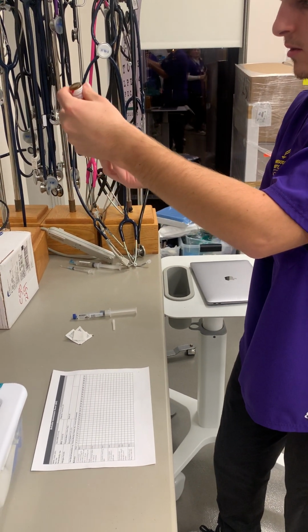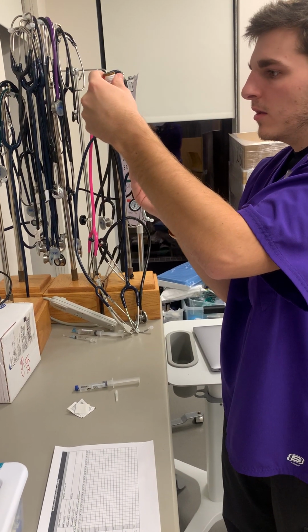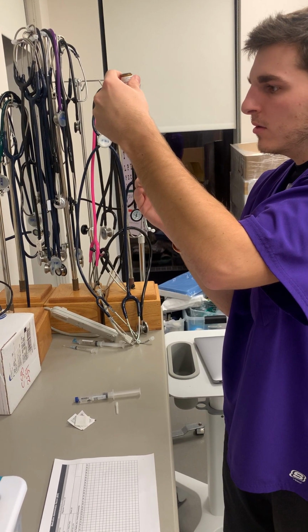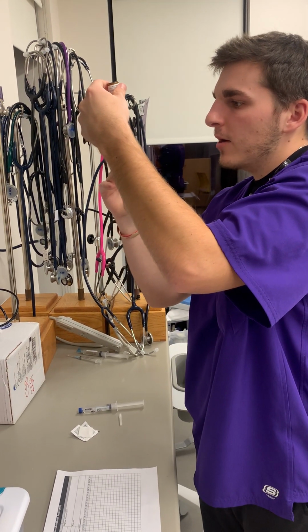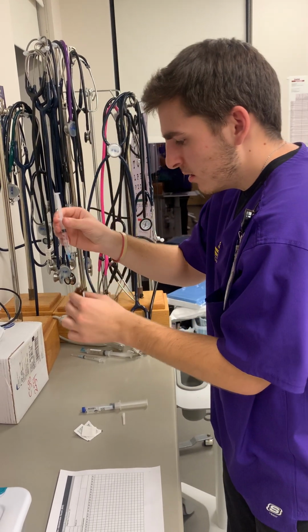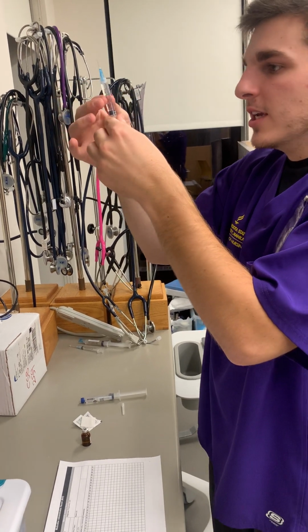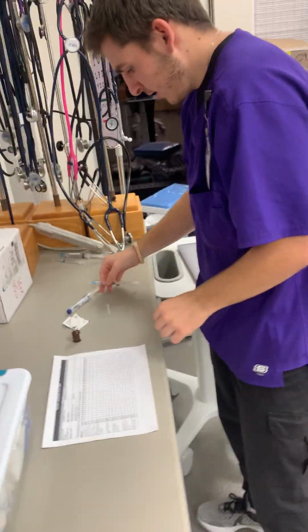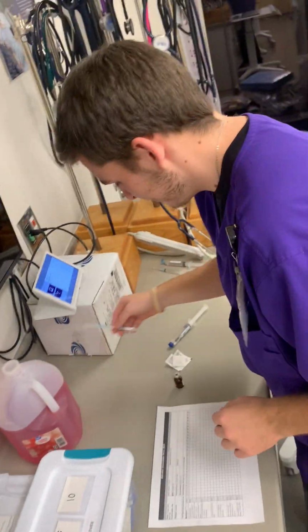Then we're going to draw this up here. And I'm going to draw a little extra because there's a little air bubble at the top, so I'm just going to push that back out. Now we're just checking for any air bubbles, which I don't see any, and we have 2.5 milliliters drawn up. And I'm going to recap the needle against the hard surface.